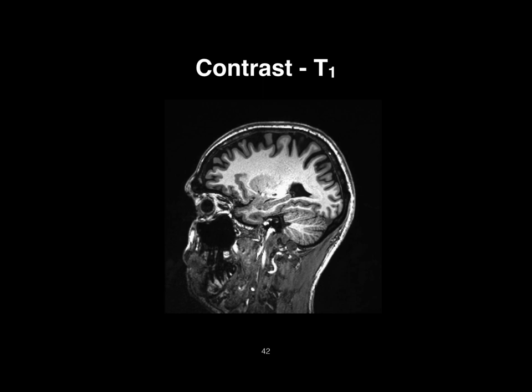In this particular imaging type, we use CSF suppression, so that's why you don't see the cerebrospinal fluid here. But that also has a relatively long T1, so it would be relatively dark in these images as well. So that's the recovery back to equilibrium.